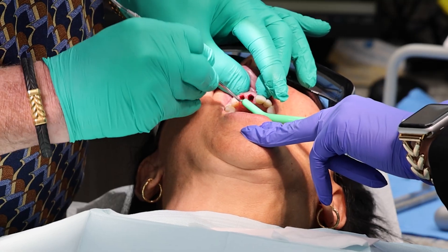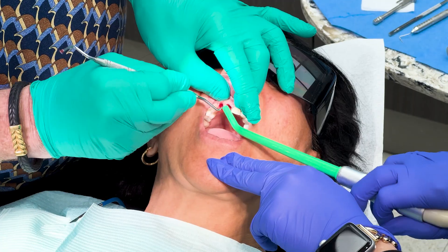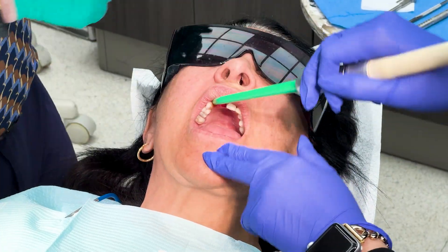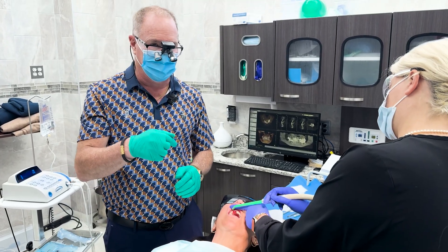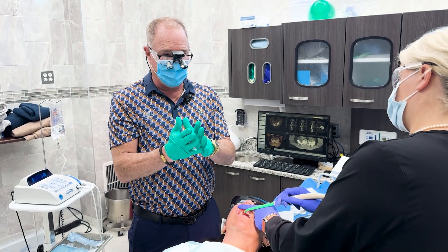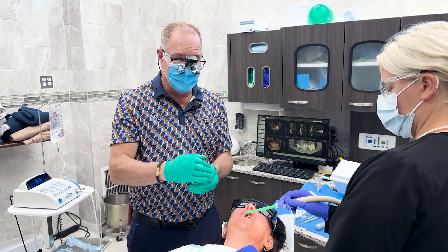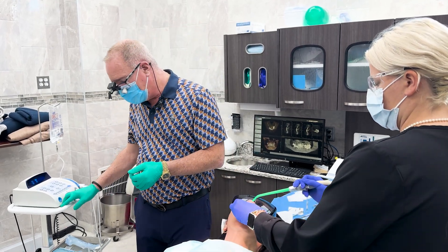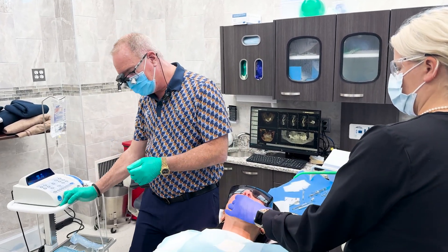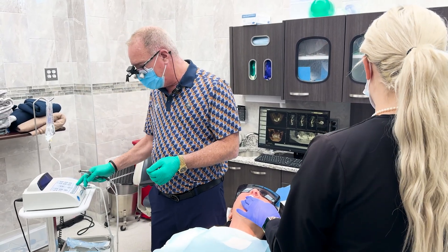The buccal plate is completely gone on number seven. But what we do when we place these implants is form a new buccal plate by angling the implant a little in the palatal direction, so the bone on the buccal of the implant is actually palatal bone. Then we pack the buccal plate with new bone — the Restore Plus bone graft material works very well for that.